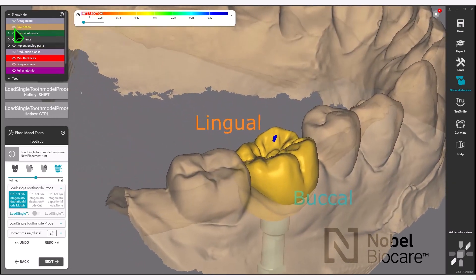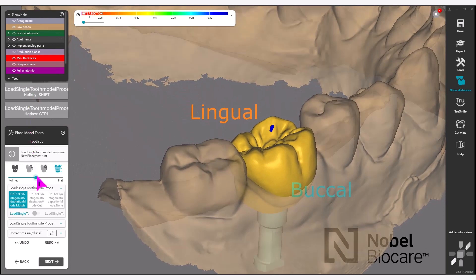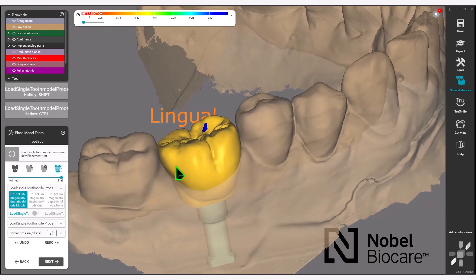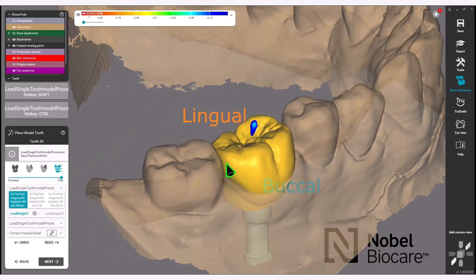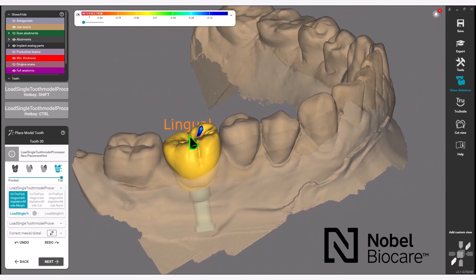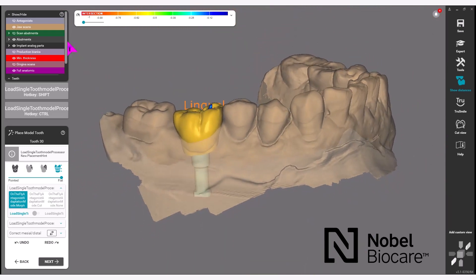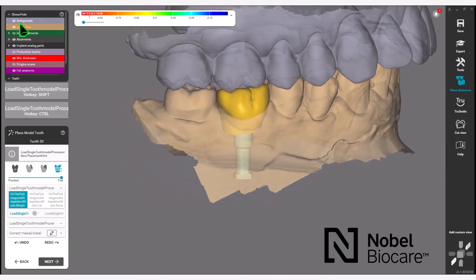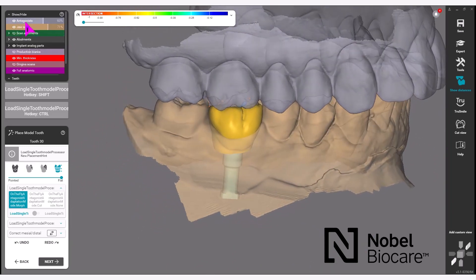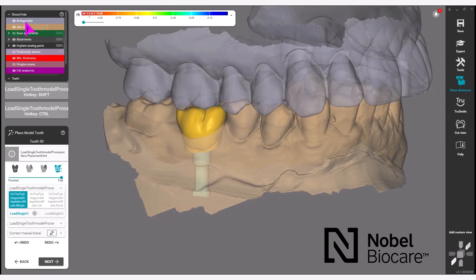Also use the Pointed or Flat feature. In this case, we will flatten the crown to match more of the existing dentition. You can turn the antagonist on and off by using the Visibility Editor on the top left.